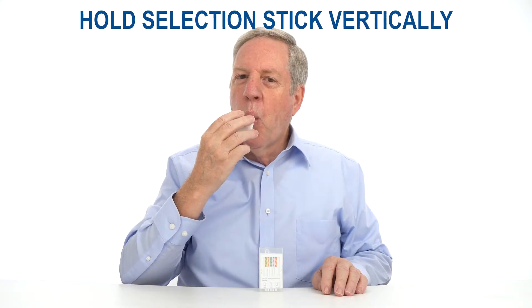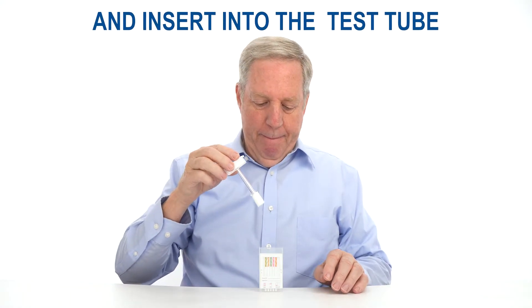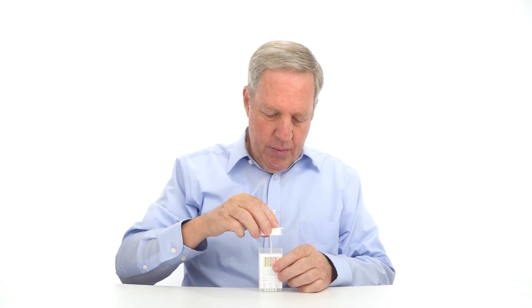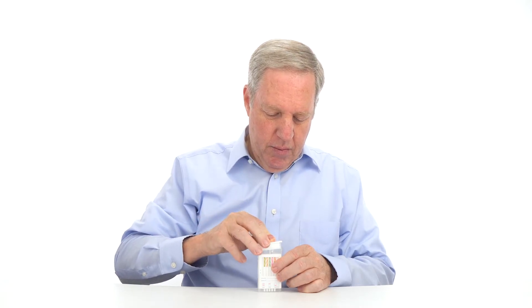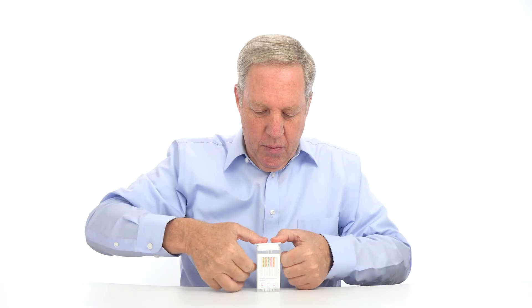Holding the collection stick vertically, insert it into the test tube, placing the groove of the collection stick into the guide rail of the test tube for a proper seal. Close the test tube by pressing down hard on the lid. The test tube should be kept in a vertical position.